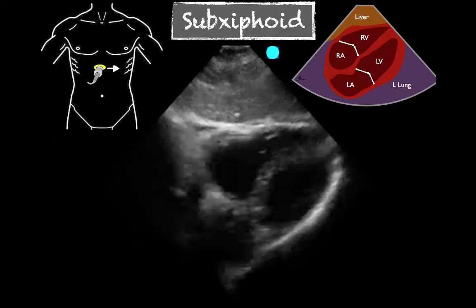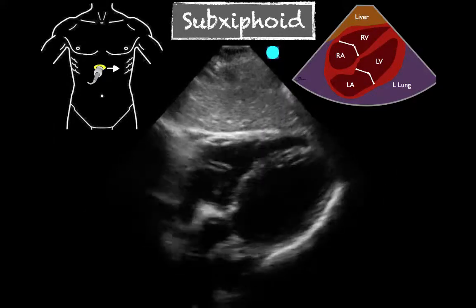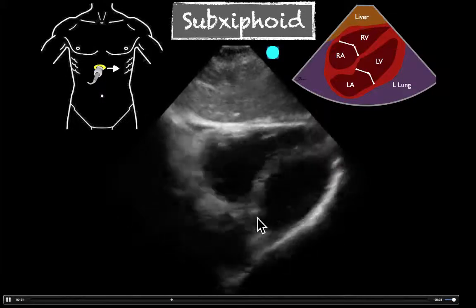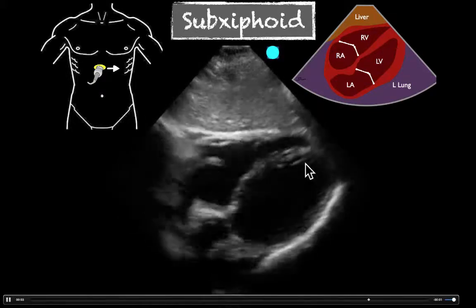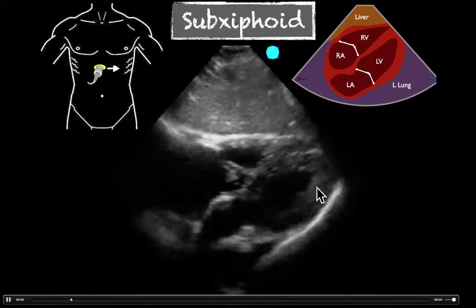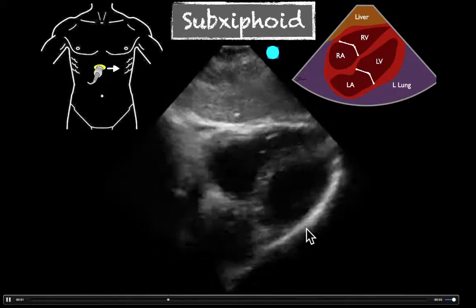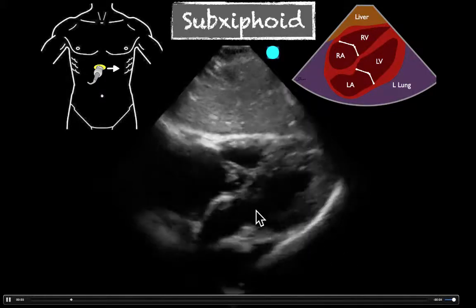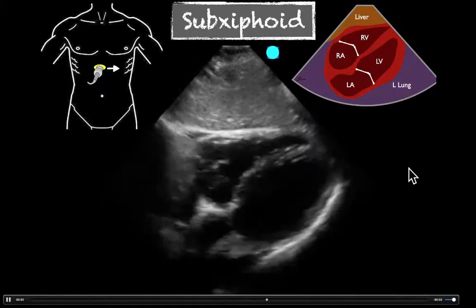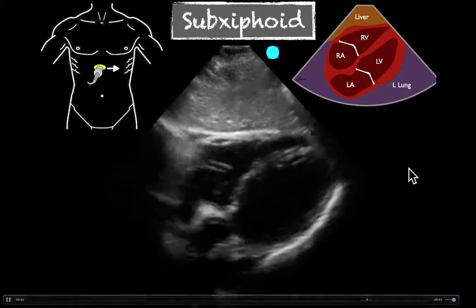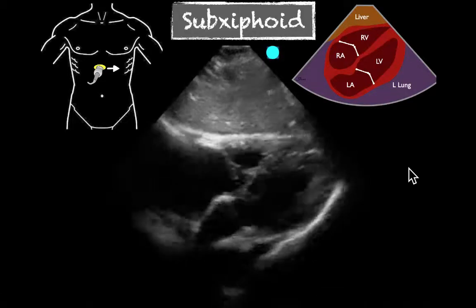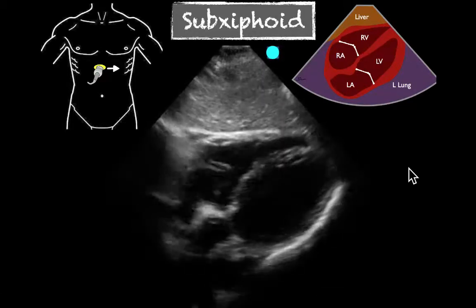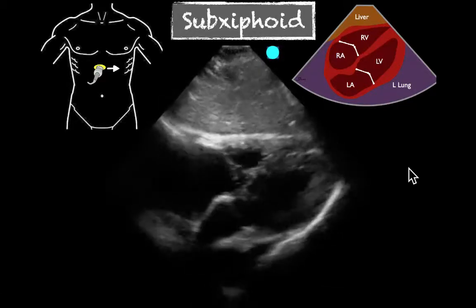On our second example, we can again recognize the thick chamber right here. Our right ventricle is lying over the top. We could have increased our gain a little bit here to see those inner walls a little bit better, but we can see that this is normal compression of that left ventricle as it collapses down and contracts to a normal ejection fraction.